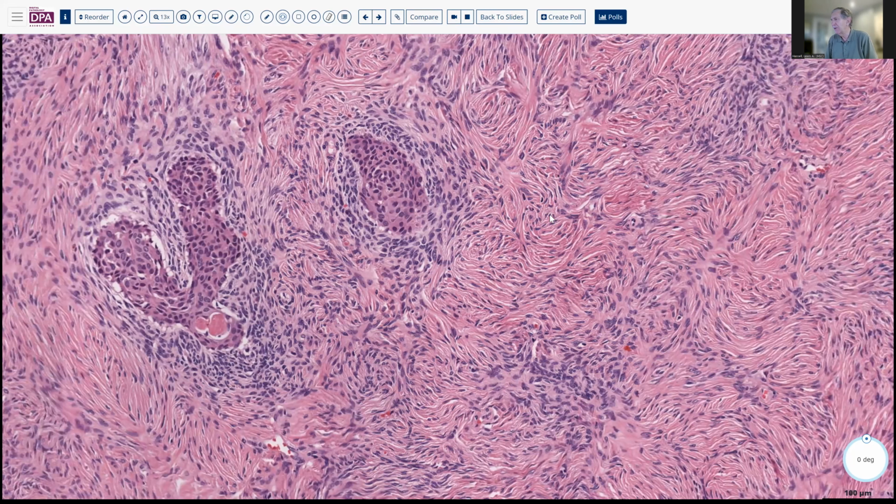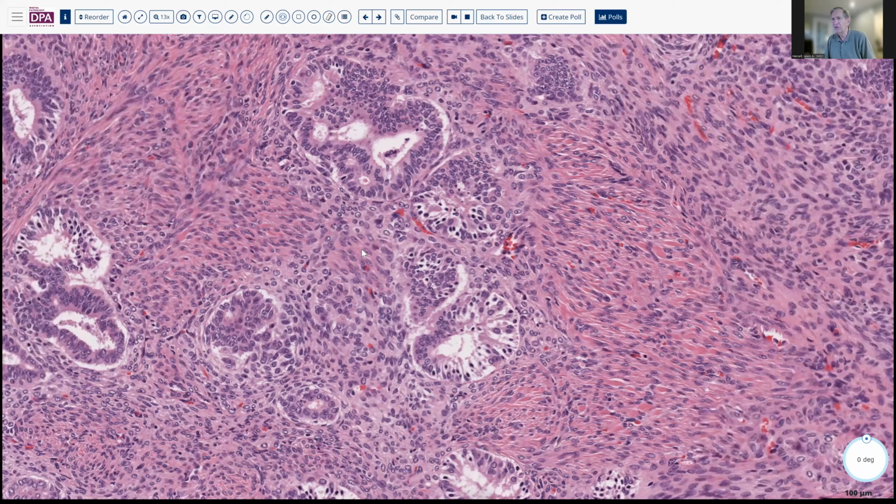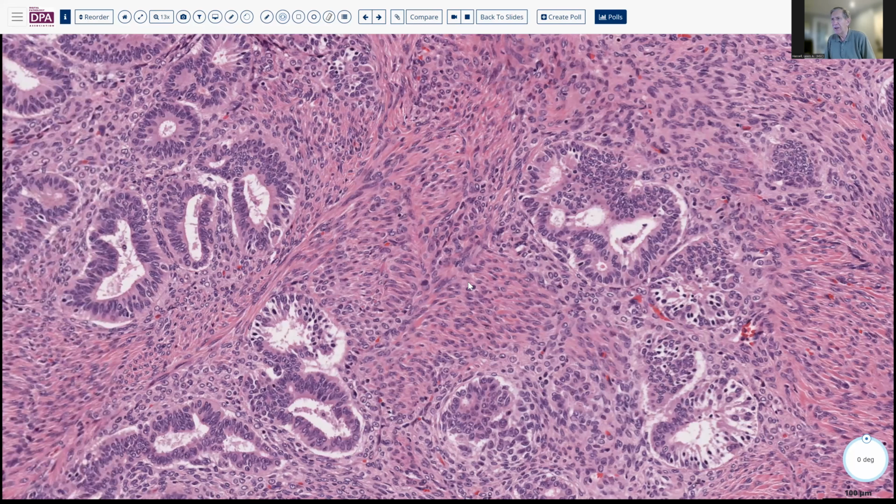And the glandular structures here now are also beginning to be a little bit more confused, a little bit of bridging or branching, gland within a gland type of appearance, bridging across and so forth. So again, the architectural pattern of the glands is becoming more complex and more indicative of there being some degree of proliferation that might indicate potential preneoplasia.